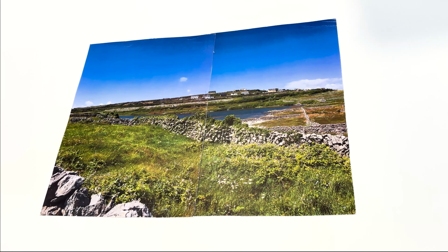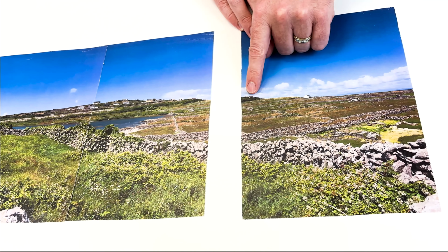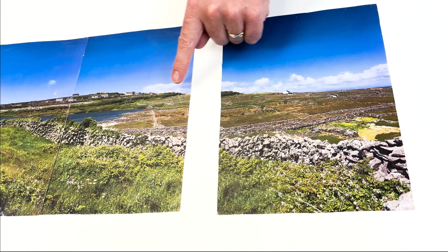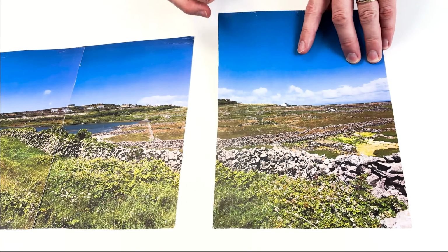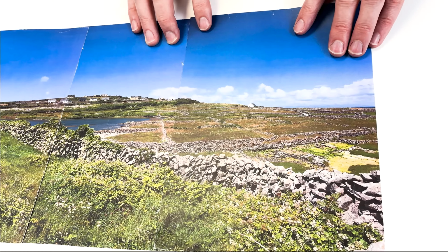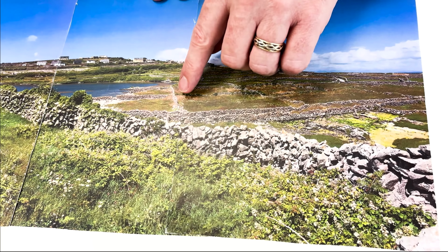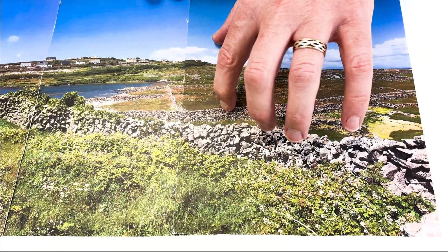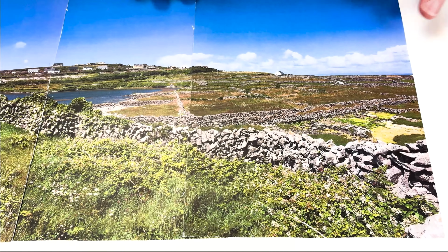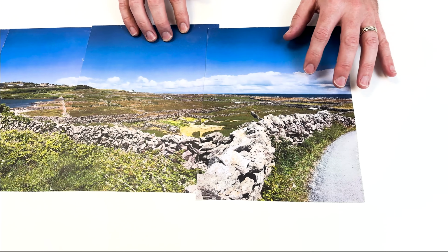And then we move on to the next one, and again, we're looking at commonality. So key things here are, we can see that there's some bushes here and some bushes here, so we know that we're going to be overlaying those to line things up. And we've got these kind of intricate stone wall patterns going on as well. So we're pretty much there as well. And we continue that process. And again, the clouds are helping us here too.